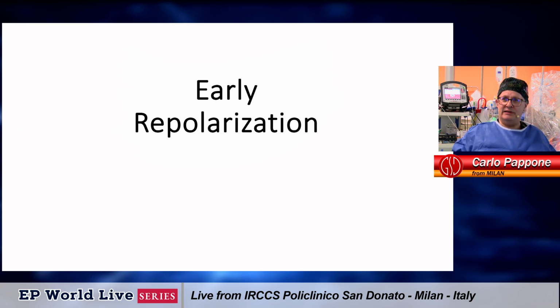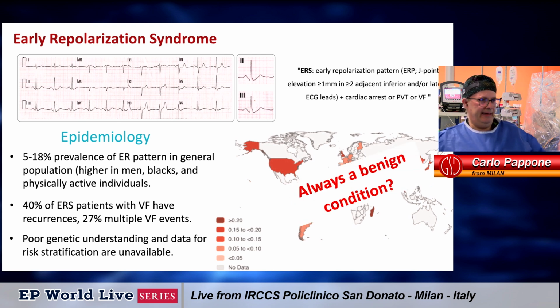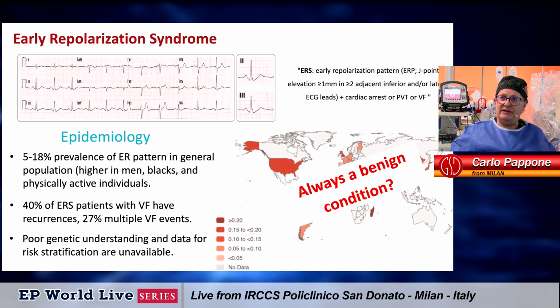You see, early repolarization is the case today. We have a very high prevalence of these EKG abnormalities, but one of the big problems is when the early repolarization is really disease or is just an aspecific representation of the EKG. For sure, when the patient has had cardiac arrest, it became interesting to explore because the early repolarization in combination with the clinical experience of cardiac arrest obliged to investigate in this direction.